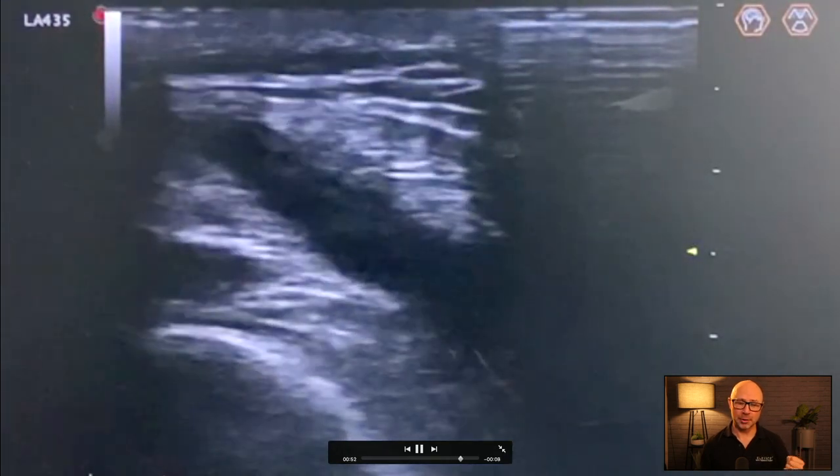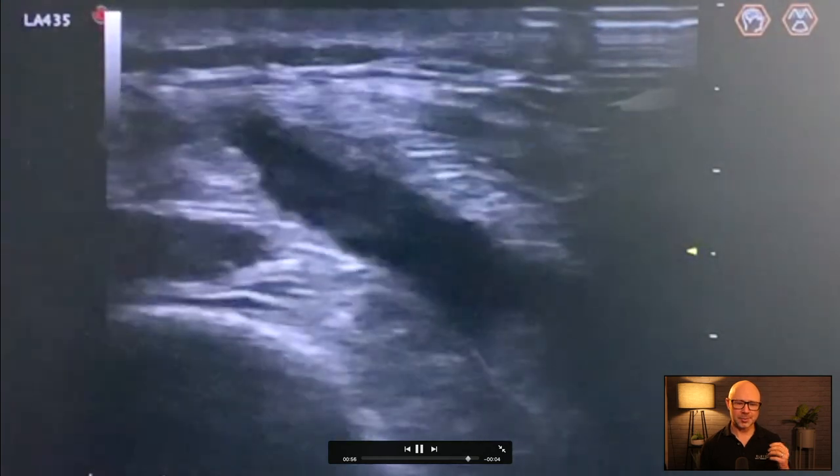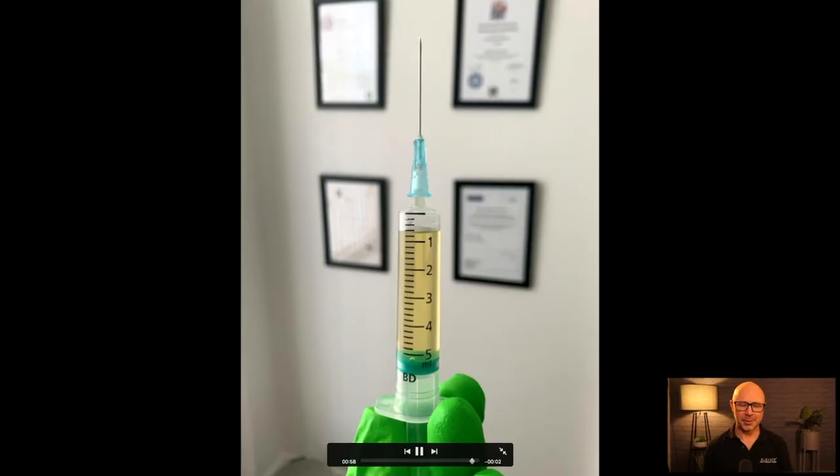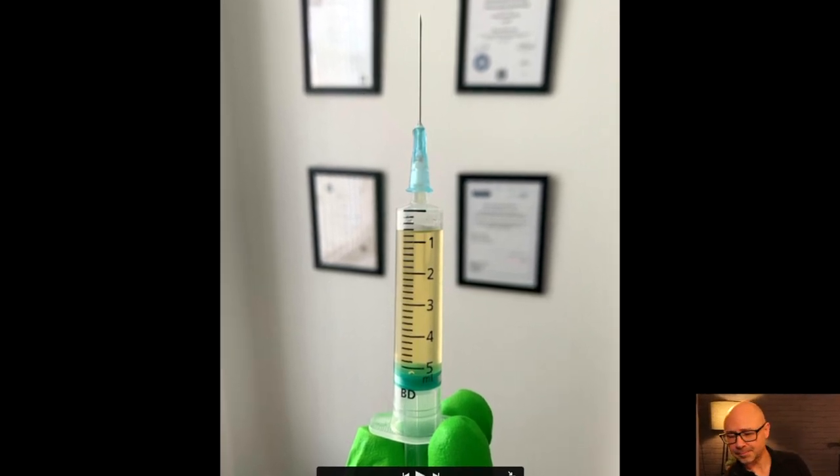That's where I started to draw the fluid off of the knee, and we got quite a nice amount. We'll see it in just a moment — there we go. I took a fair bit of fluid off the knee; there was more that I could have taken off for sure.